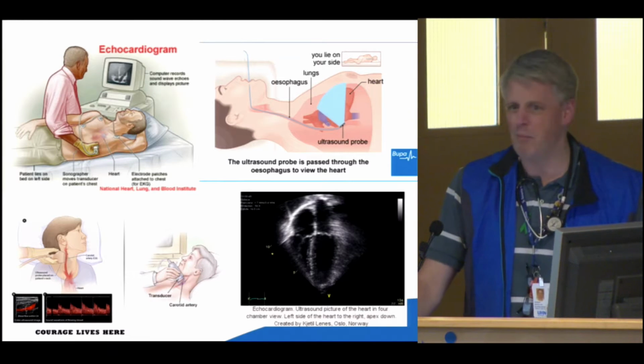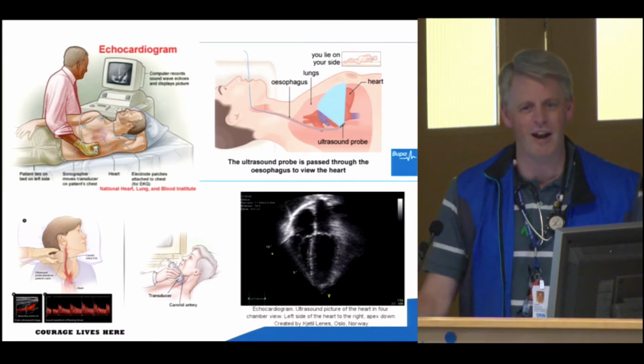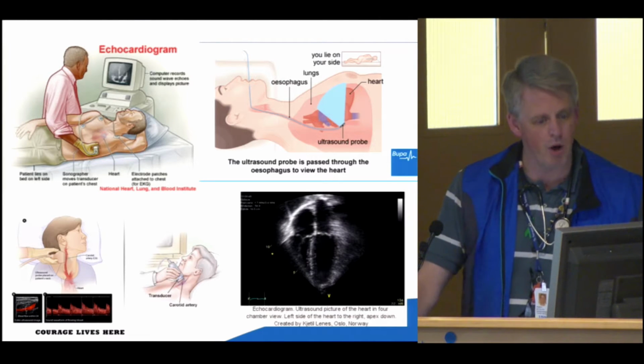And this bottom picture here on your bottom right is pretty much what the doctor's seeing. All right? I always tell people, if you want to know what an echo looks like, just pull a cable out of your TV. That's what an echo looks like. So you can see, in this picture, which is reasonable, you can see the 4 chambers, 2 in the top and 2 in the bottom.